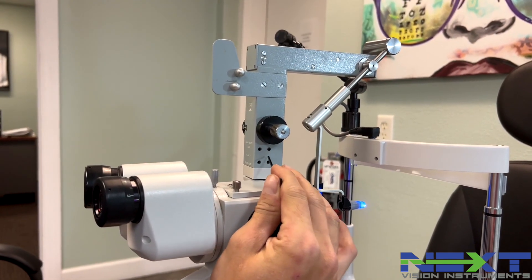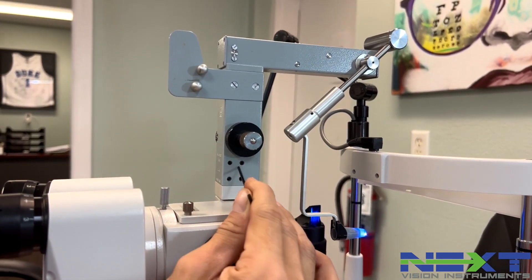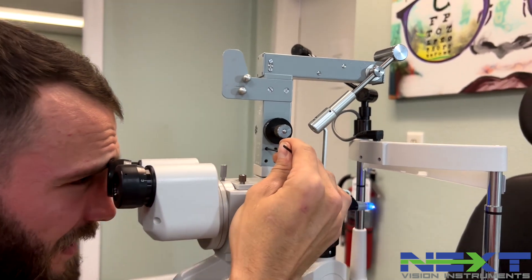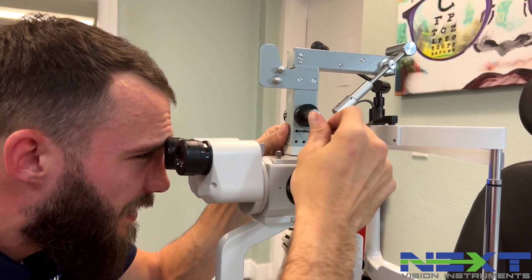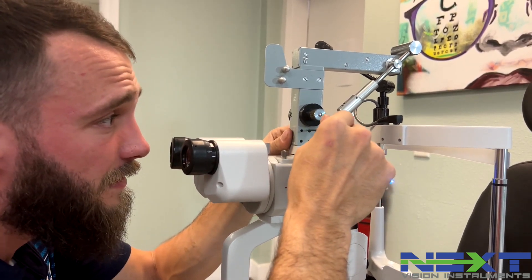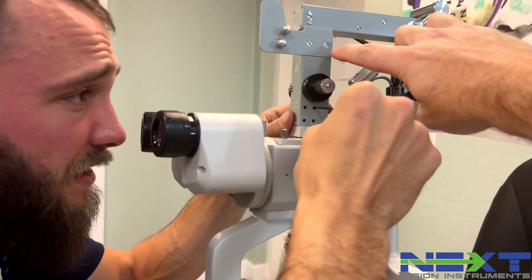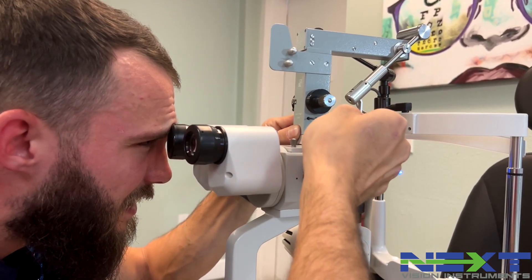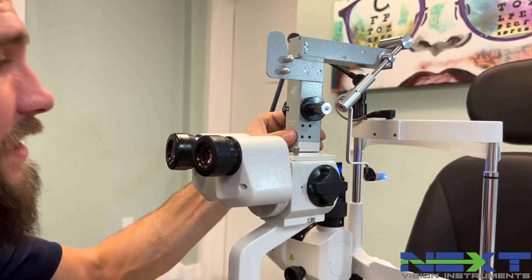Most tonometers only have two Allen screws to align with, and this one has both on top. Start by looking in and getting it slightly aligned, then tighten down one of the screws, followed by the second screw. He's holding it and adjusting it with one hand, and when it's in position, tightens the Allens. It's as easy as that.